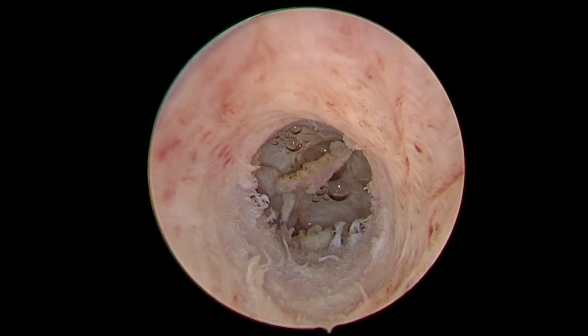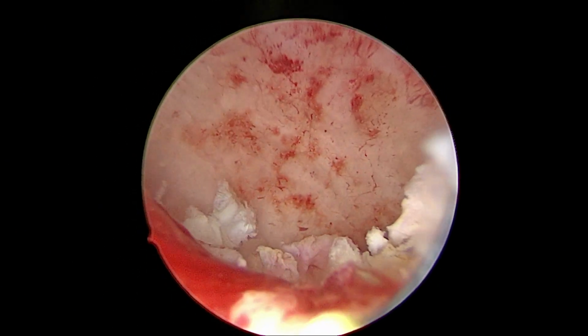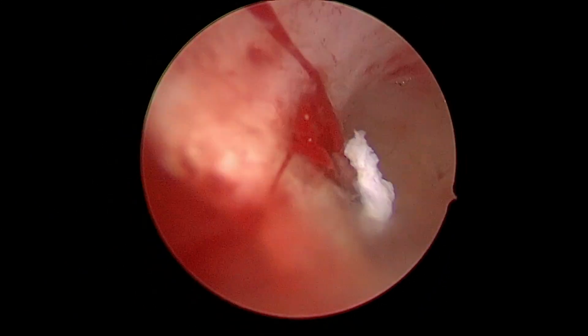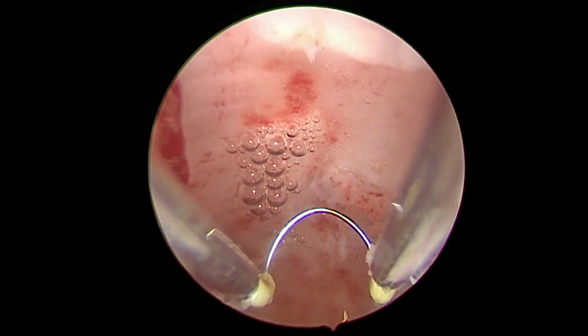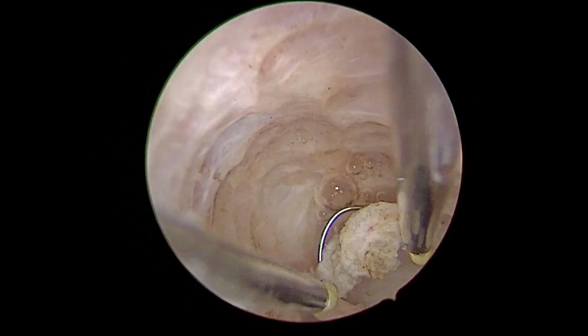Then we come out. Now we can see that when we are going in, we can see the base of the isthmocele as well. So that means the bank is excised nicely, and now the chances of fluid getting accumulated in the isthmocele and not coming out are very less. Why? Because the bank is smooth. The margin is very smooth.